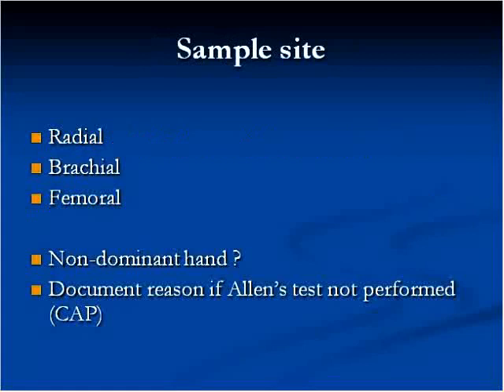Also, if it is not done, I am aware of places that have said that CAP asked that it be charted as to the reason it was not performed.